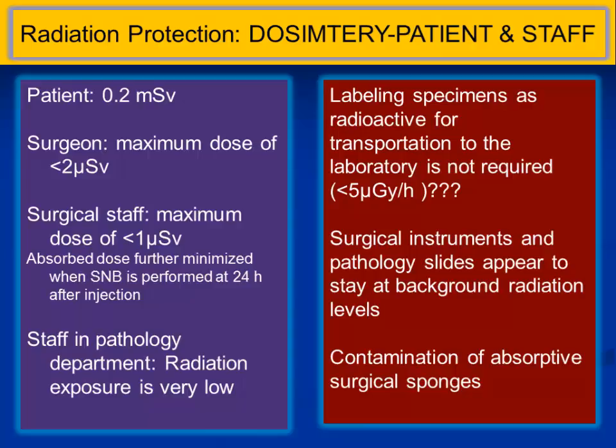Therefore, they're quite safe. If the staff member is pregnant, they can at least do up to 150 cases per year. If she's a scrub nurse in the theater and says that because of the radiation she doesn't want to work, you can tell her she can safely do up to 150 cases a year. Even then, she's not going to exceed the limit.